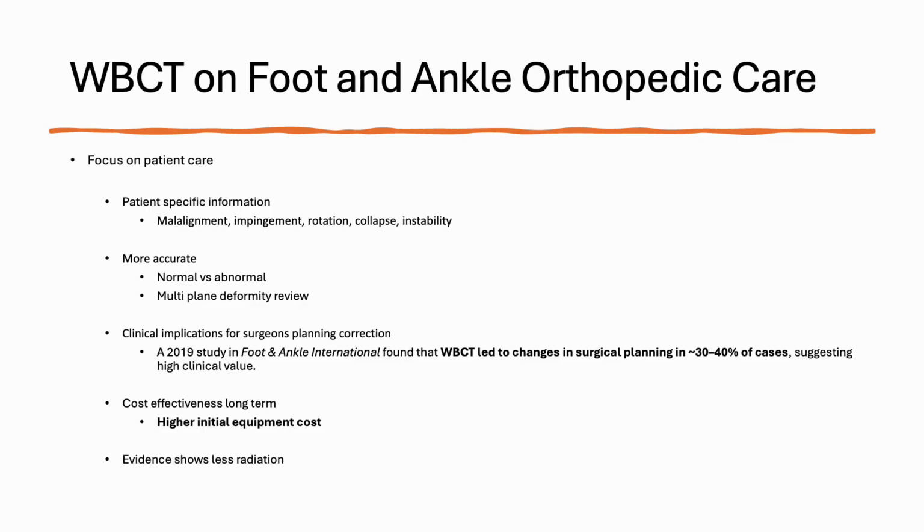It will pay for itself after that first year if you use it correctly, and using it on quite a bit of deformities. I haven't got pushback from a lot of insurance companies on using it for deformities, bunions. I always just dictate that I'm using it for arthritis evaluation, stuff like that we normally typically would use. It plugs into a standard wall.